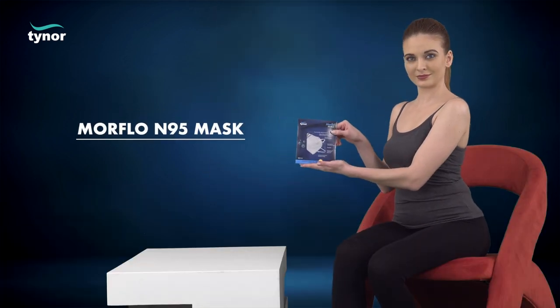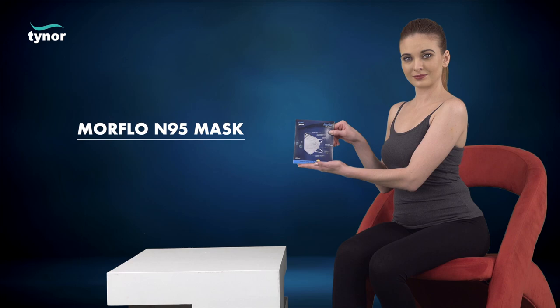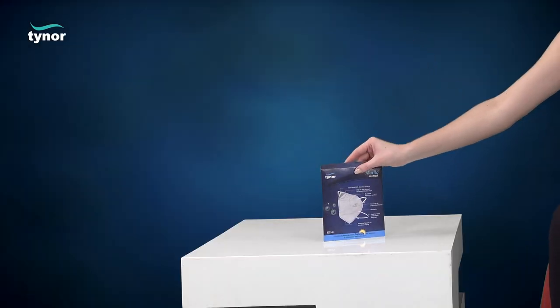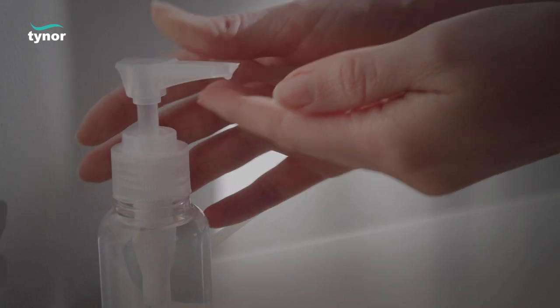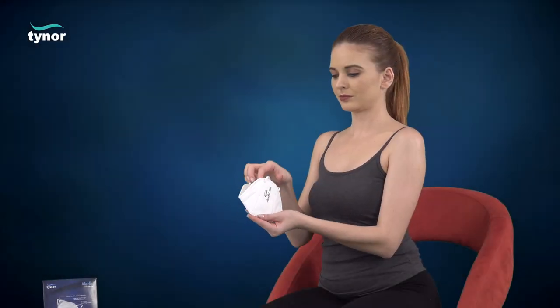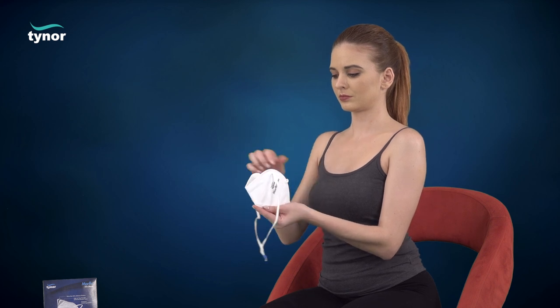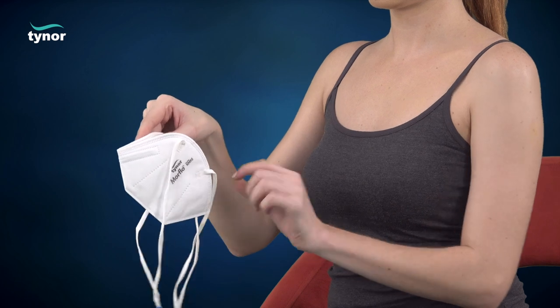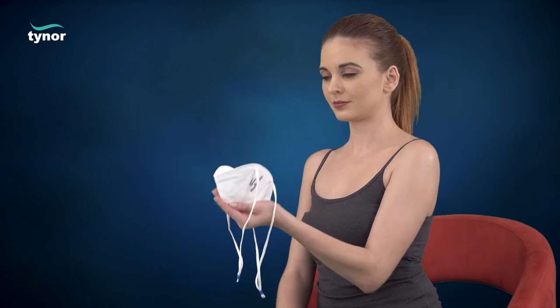Here we will discuss how to use the Moreflow N95 mask. Sanitize your hands. Cup the mask in your hand with the nose clip towards the fingers and straps hanging down. Position the mask on the chin with the nose clip up.